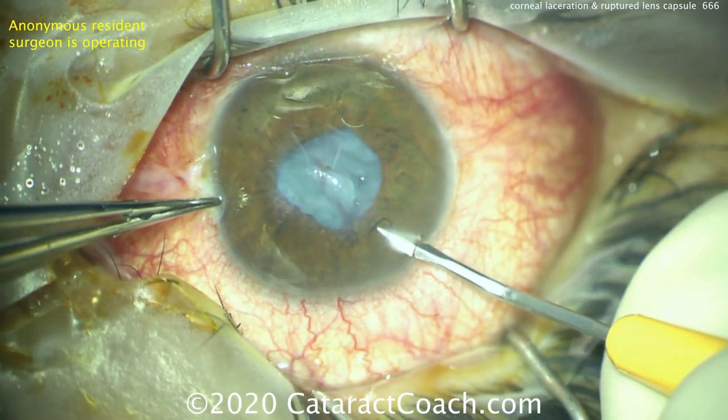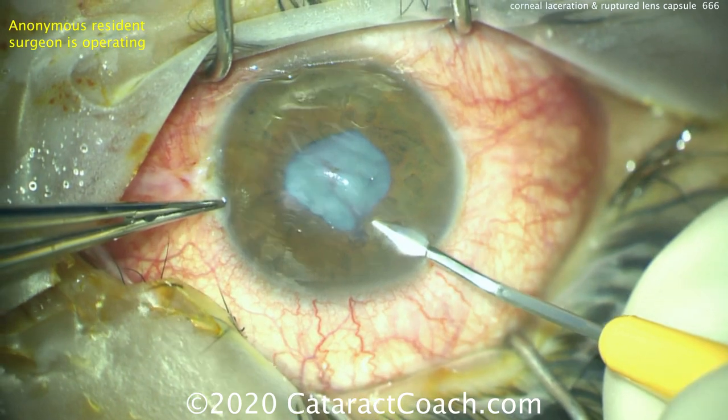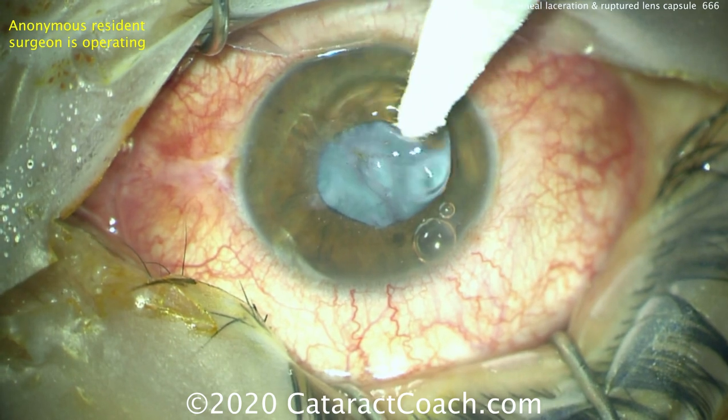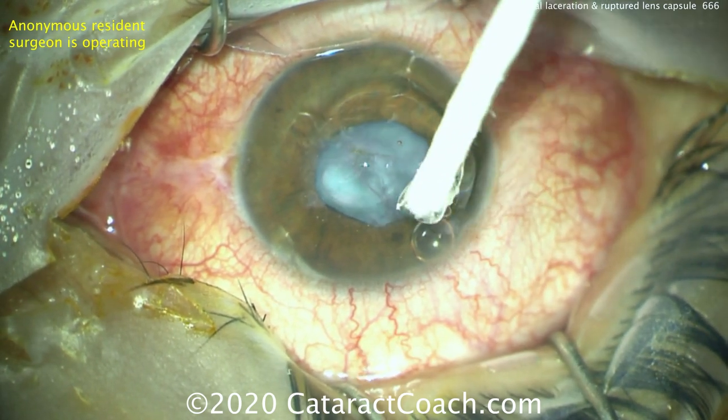We'll then fill the eye with our dispersive viscoelastic. It's important here to avoid hitting the iris. Once we have the dispersive viscoelastic, we can see the extent of the laceration of the cornea.